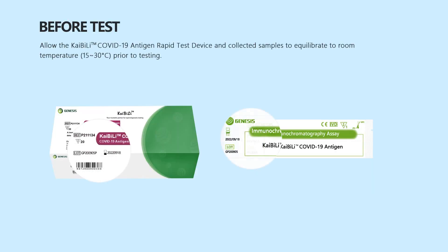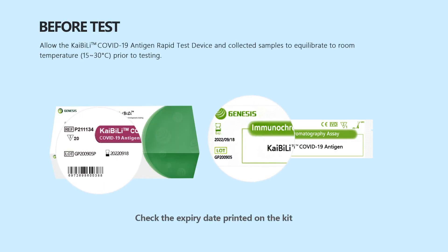Allow the Kybele COVID-19 antigen rapid test device and collected samples to equilibrate to room temperature, 15 to 30 degrees centigrade, prior to testing. Check the expiry date printed on the kit.